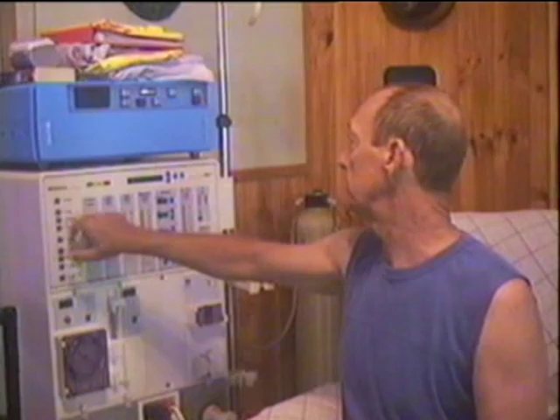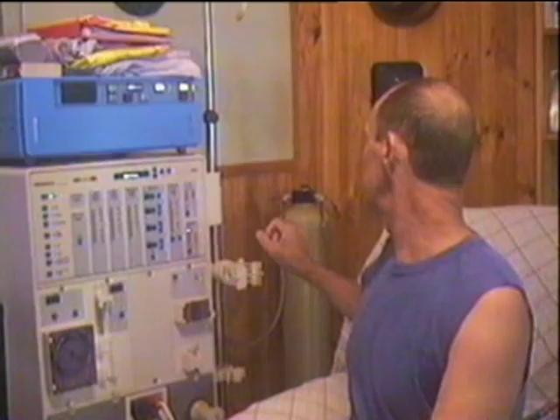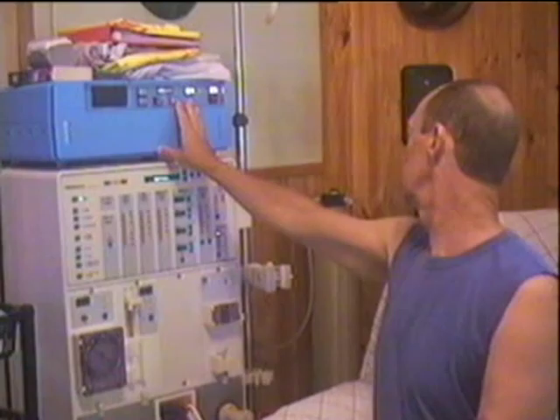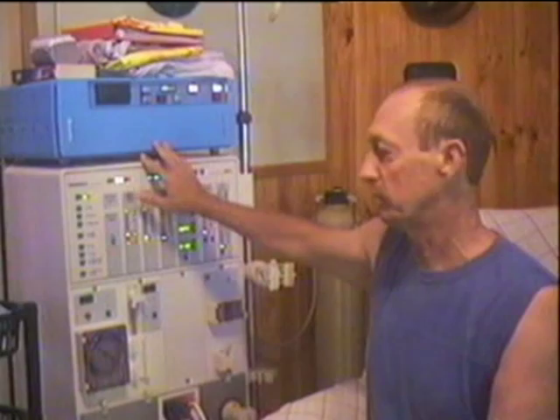Firstly, we'll start by turning the machine on. The water gets filtered through two filters — a charcoal filter and a membrane filter. So by the time the water gets to mix with your blood, it's fairly clean.